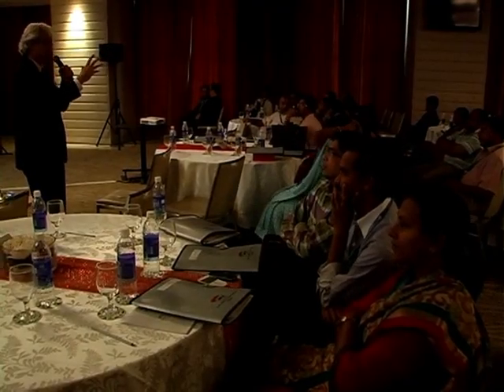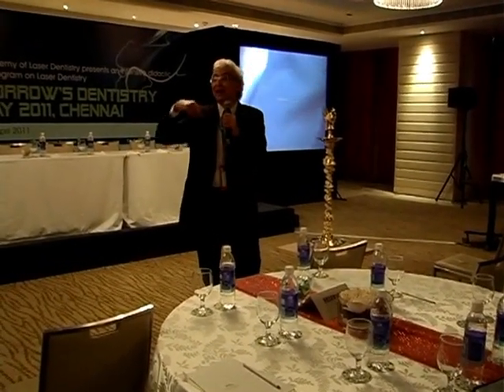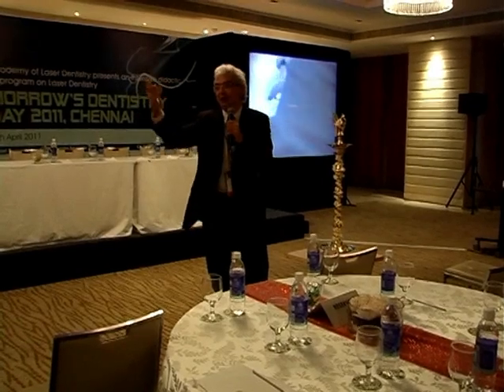It's a laser which works on the principle of fluorescence. Does anybody understand the concept of fluorescence? The fluorescence is absorption of the laser wavelength, and then it emits a different wavelength or the same wavelength, but you get a glow.